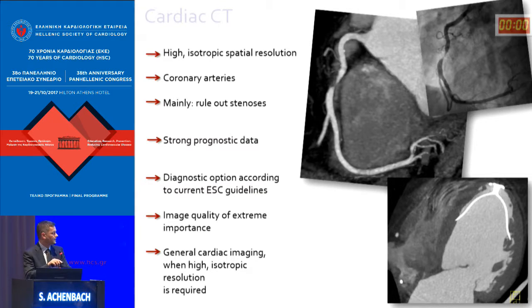And besides the coronary arteries, CT can also be used for general morphology imaging of the heart in those situations where very high isotropic resolution is required.